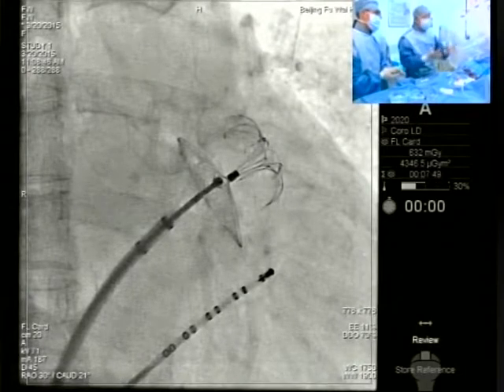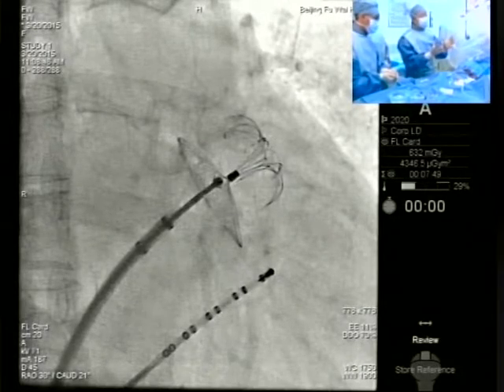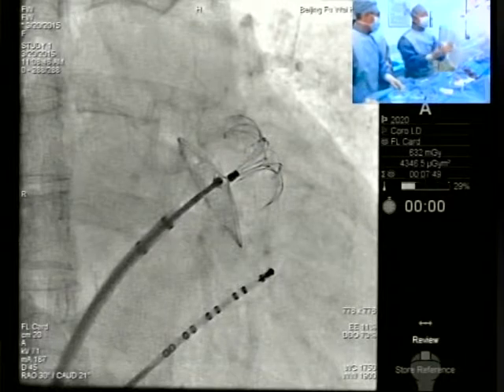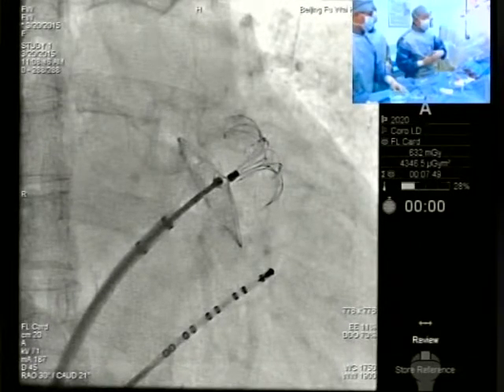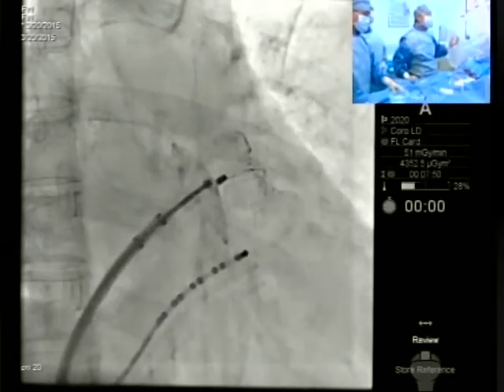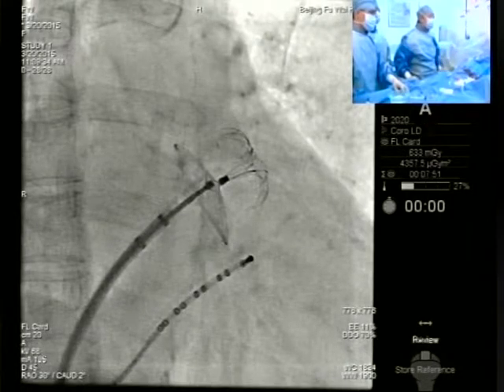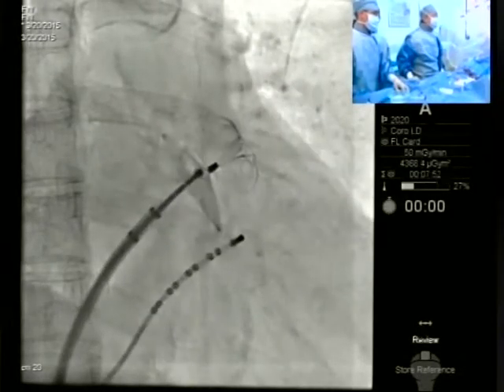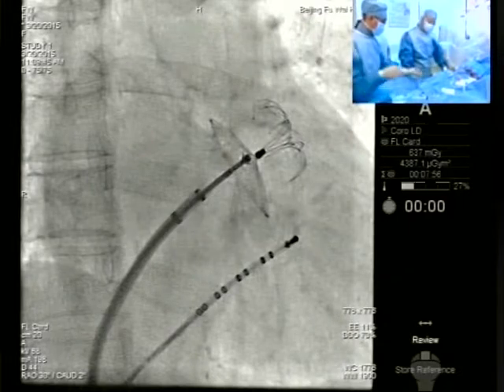Because if I deploy the device, the disc, the appendage, which is normally anteriorly rotated, turns anterior to its original position, which was, before I deployed the disc, stretched. And so I can early estimate how strong the rotation of the appendage body is behind the neck. So this is not that much rotated. Now I do a second angio control.